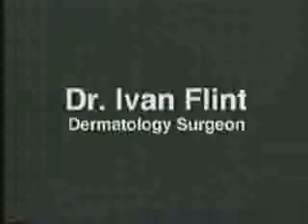Everyone that has been introduced to the cryoEMBEDDER system has been impressed with the quality of the results. The cryoEMBEDDER is a wonderful tool for Mohs surgeons. It speeds the process of mounting tissue. It helps me to get a complete skin edge on my first sections better than any technique I have ever used. It also helps me to get the skin edges laid down without them rolling. I highly recommend the cryoEMBEDDER for any Mohs surgeon, which I believe will help all Mohs surgeons to get better results and more accurate results.